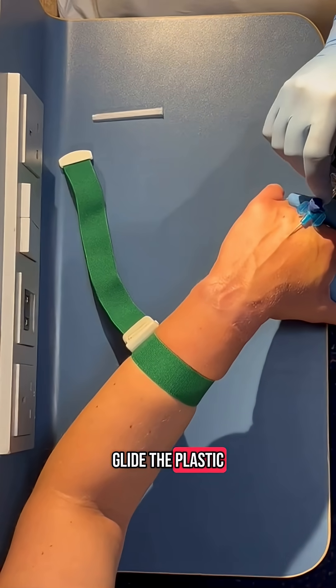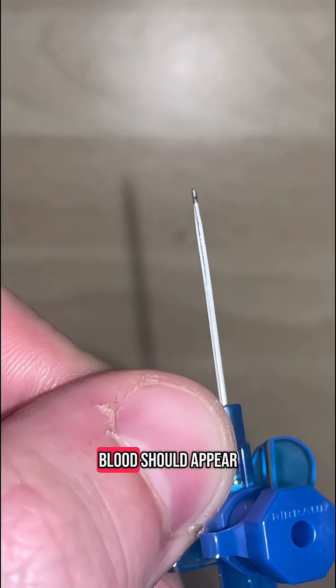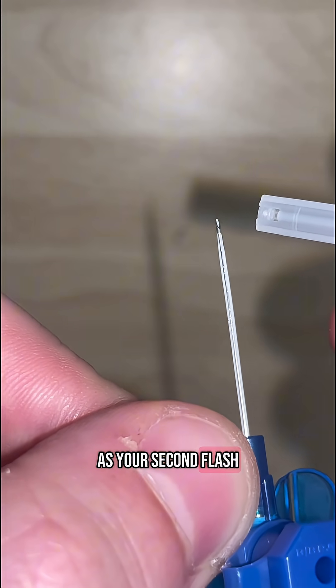Next, glide the plastic catheter over the top of the needle so it remains in the vein. Blood should appear in the plastic catheter when you do this. This is known as your second flash.